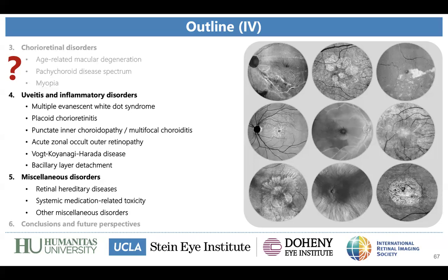It will be interesting, in my opinion, to further study these patterns, also to understand if, for example, the presence of choroidal anastomosis between different drainage systems can be associated with differential lesions, for example, pigment epitheliopathy, but also CSR manifestations. And for sure, the main advantage of en face OCT is its non-invasive nature.